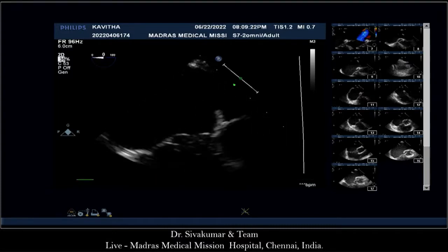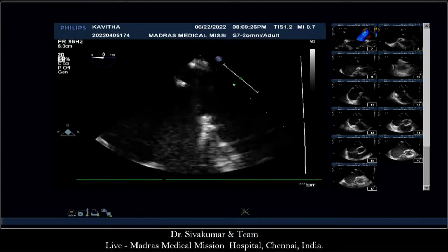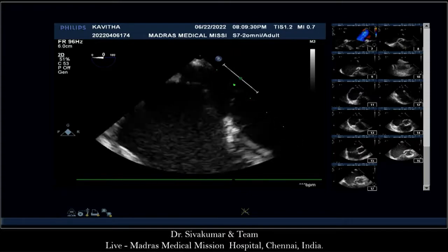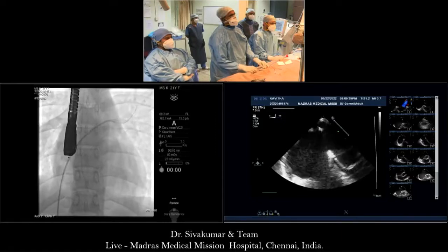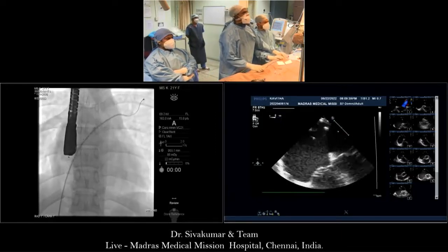Say it again. Okay. So I measure the defect in 3 views: short axis, bicaval, and four chambers. Okay, and I will include the thin, flimsy septum on each side, and then I will take the average diameter.